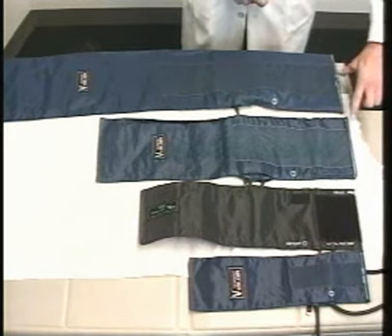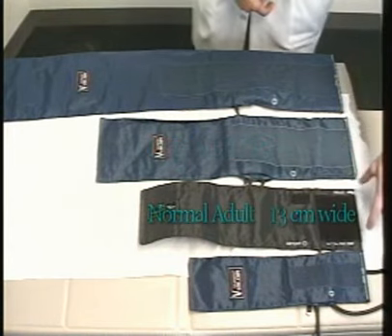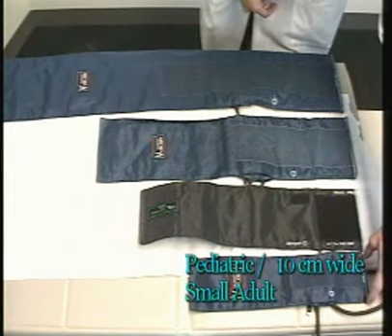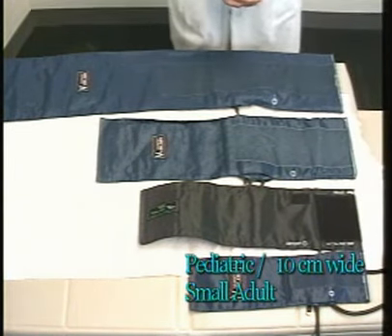The next largest cuff is known as a large adult blood pressure cuff, and this one is approximately 15 centimeters wide. Then we have the normal adult blood pressure cuff, and it is about 12 or 13 centimeters wide. And finally, we have the smallest blood pressure cuff, which can be known as a pediatric or small adult cuff, and this one is about 10 centimeters wide.